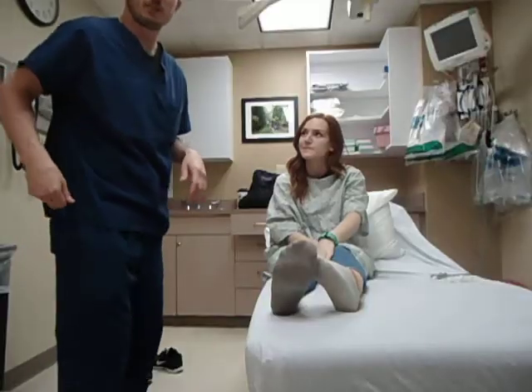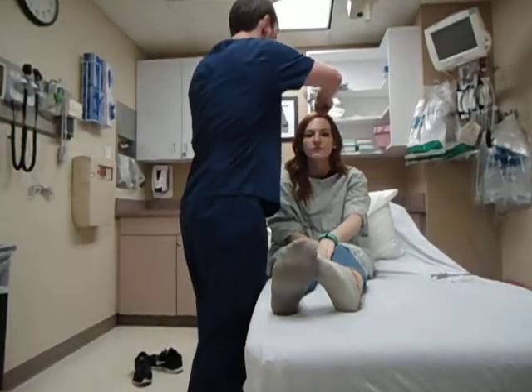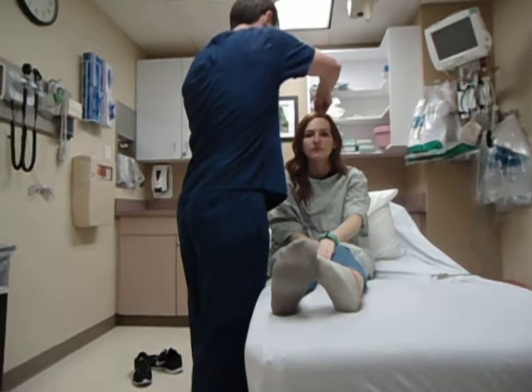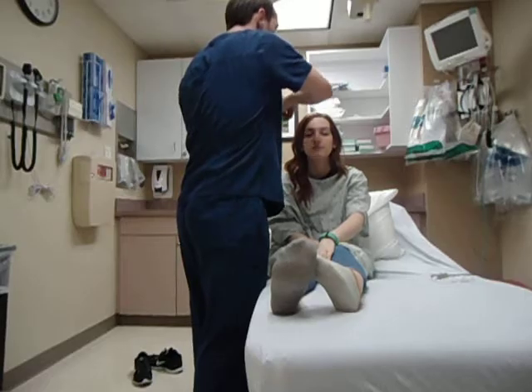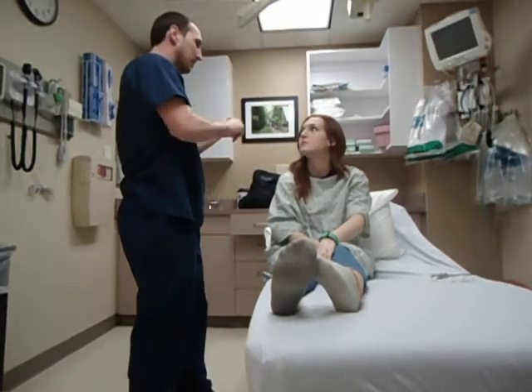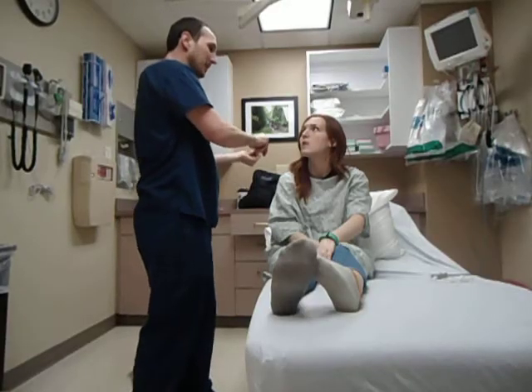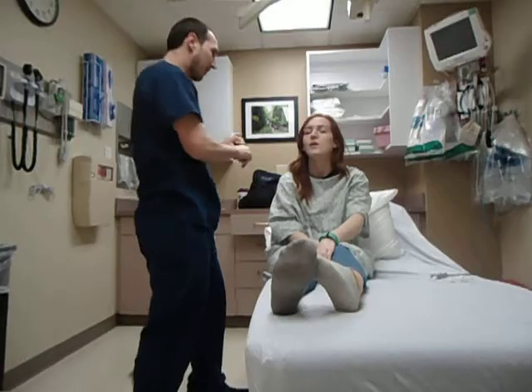I'll go ahead and do my tuning fork, my Weber test. Just tell me when you stop hearing it. No. Okay. And I'll go ahead and do my Rinne test. I'm going to do it on the back of your ear, and then I'm going to place it on the side of your ear, and you just tell me when you stop hearing it, okay?